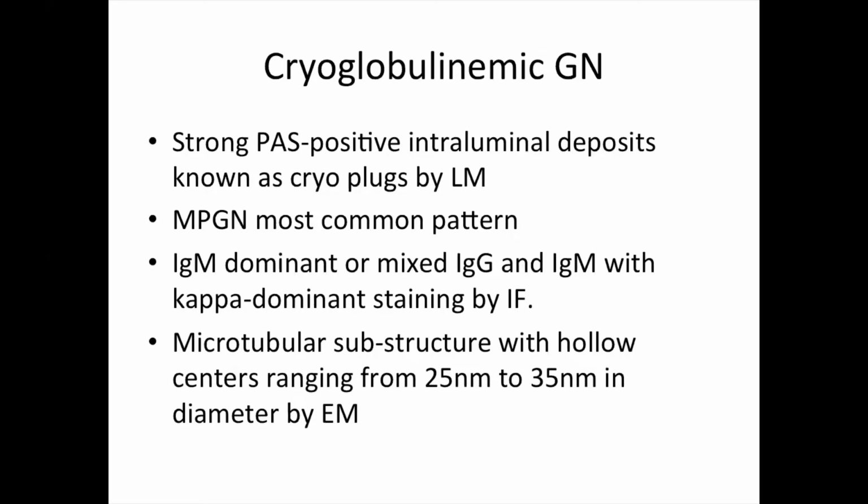If you didn't do the electron microscopy, it is better to say that this is a glomerulonephritis with features that are suggestive of or highly suspicious of cryoglobulinemia glomerulonephritis. CD68 طبعا زي ما قلنا في الاميونوهيستوكيمستري إذا سويناه is very supportive. Okay, right.